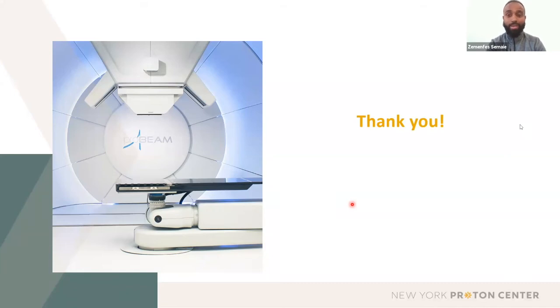And we had many patients, mainly pediatrics, that were able to hold their breath for a minute and 5 seconds, so they're able to hold it for the whole entire beam. Like I said, our first ever Proton patient at Inova SHAR was a 17-year-old pediatric. He had one beam, and he used to get it done in about 35, 40 seconds. So you'll be surprised how much the kids are able to understand and use the system.